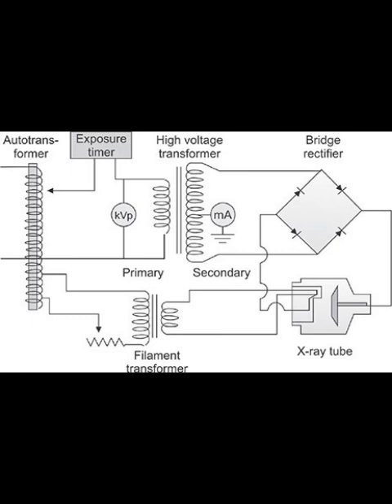And why is that good? Because lower ripple equals more consistent X-ray production. The energy of the X-rays being produced is more uniform. Okay, less variation. Yes. And this ties directly into frequency. Modern high-frequency generators operate at much higher frequencies than the standard 50 or 60 hertz. Thousands of hertz, right. Tens of thousands, even hundreds of thousands of hertz. And the physics works out that higher frequency leads to significantly lower voltage ripple.